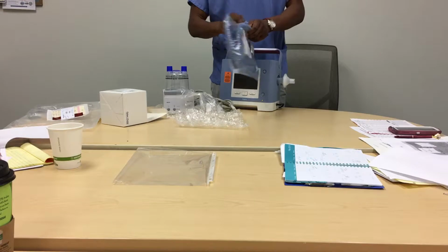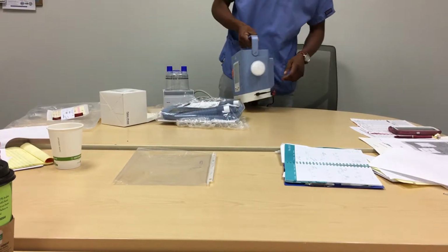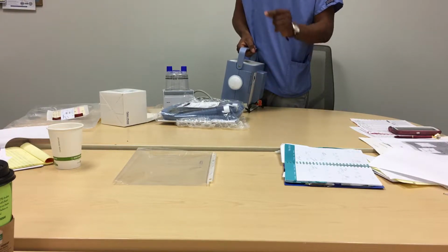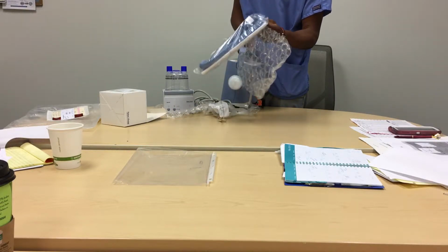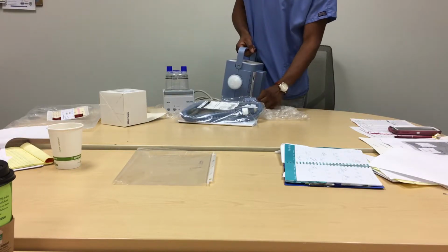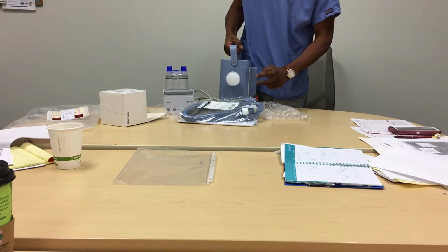Now, you have your passive circuit. Speaking to that, if they are trached, there'll be a connector here that you could connect your exhalation ports to, depending on the circuit you use. If it's an active circuit, they'll connect it here. So you just unscrew this end, take it out, and put in the new connector.